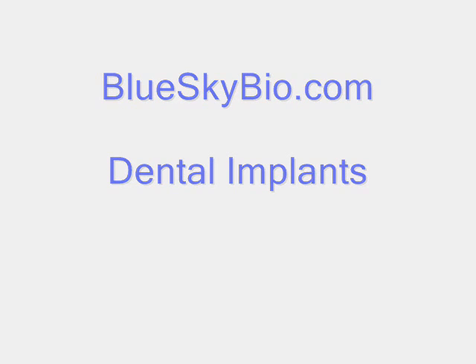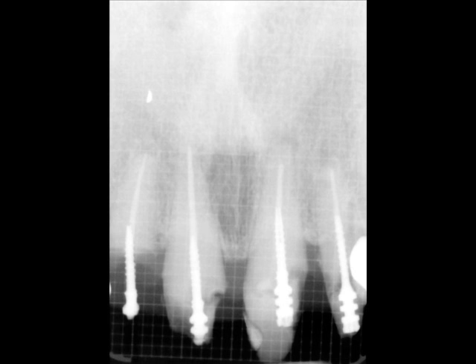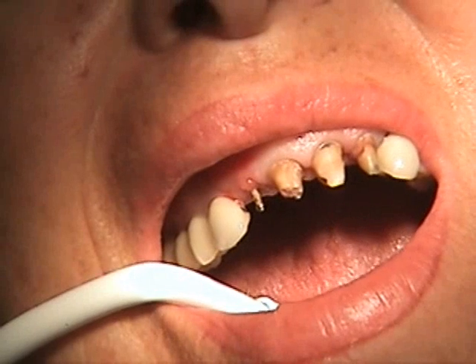BlueSkyBio.com is proud to present the use of the Sapien Root Remover in extraction and immediate placement. Here's the preop: a broken right lateral incisor.